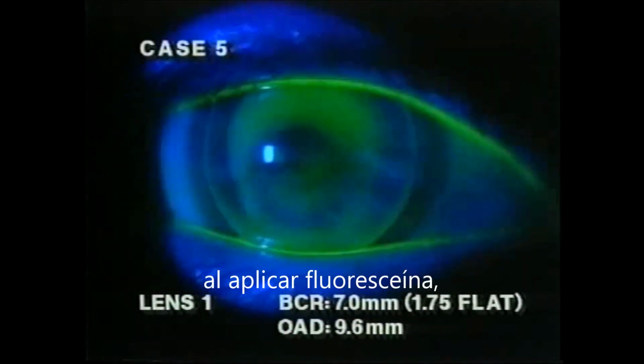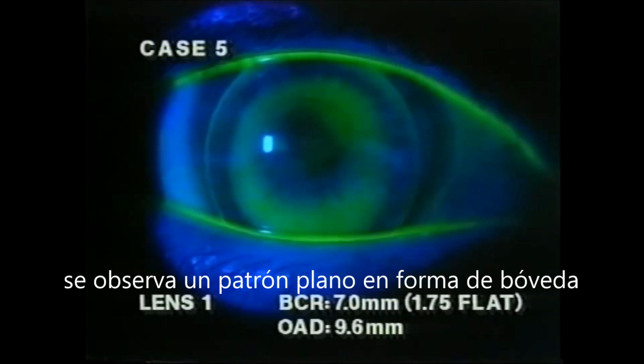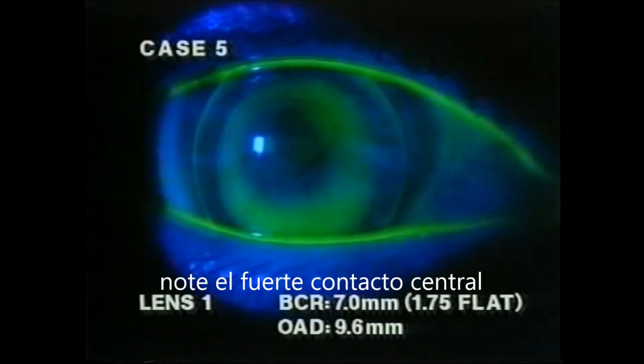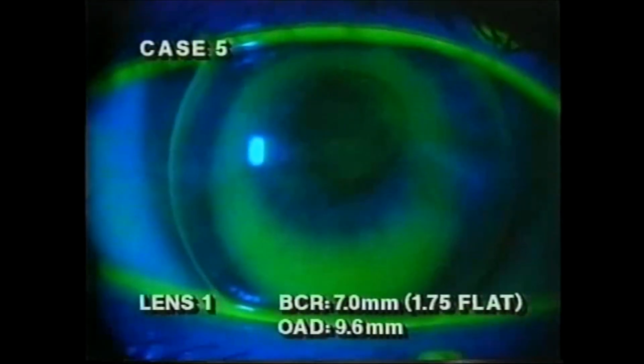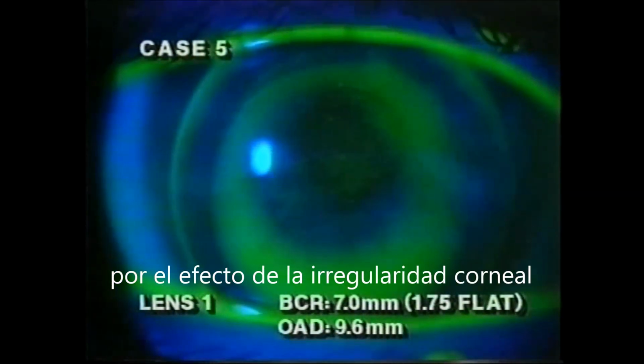With fluorescein application, a flat-fit bullseye pattern can be observed, a clear indication of poor corneal alignment. Note the heavy central and peripheral bearing along with paracentral pooling. The central corneal staining observed is caused by pressure or bearing exerted by the flat base curve.